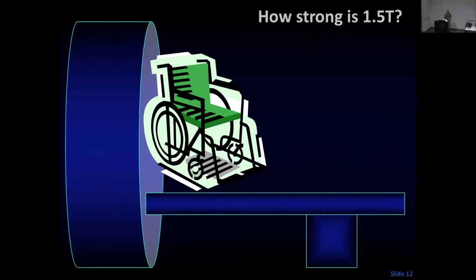And people occasionally, not commonly, but there's occasional deaths of human beings because there's a projectile in the room that just by bad luck happens to hit someone in the body or in the head. So be very careful with this, okay?